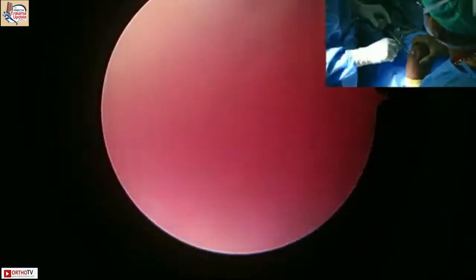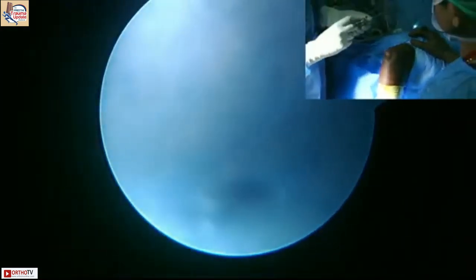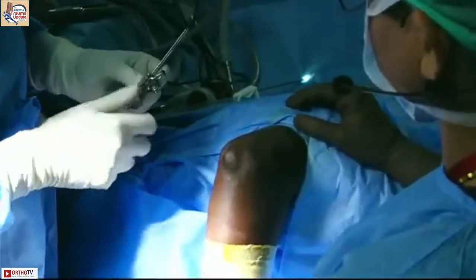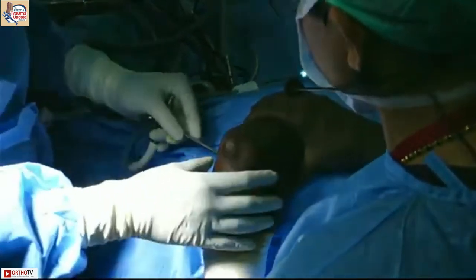So your viewing portal is always proximal and medial, right? Yes. So the first portal is proximal medial. Once you get into the joint, then you can use the needle to direct you for other portals, so under vision. So the first portal will invariably be blind, right?